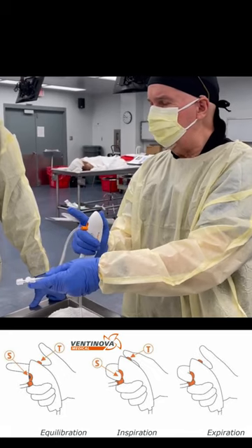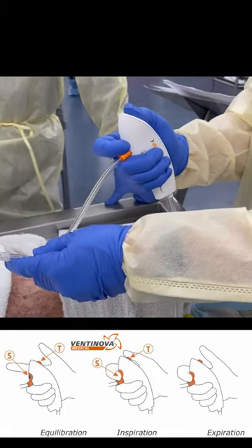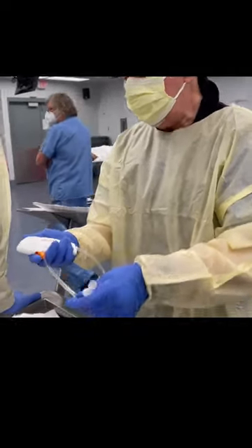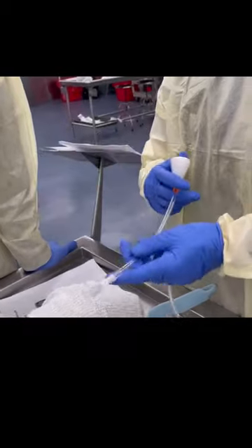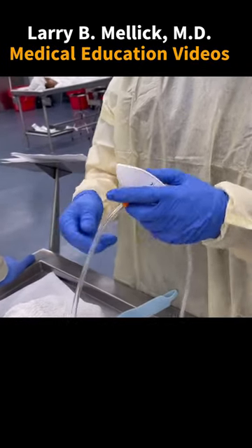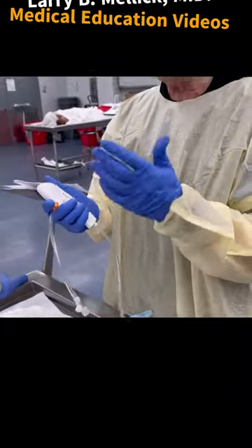Two ports. The top port is for sucking it out. The bottom port is for passive expiration. The Ventrain device is a device that I think is perfect for transtracheal jet ventilation. It has the option to actually ventilate the patient.